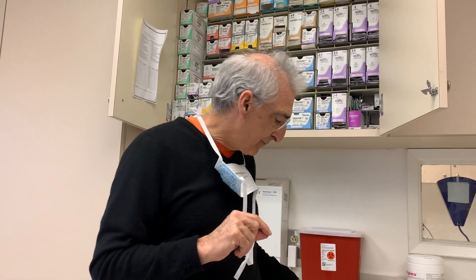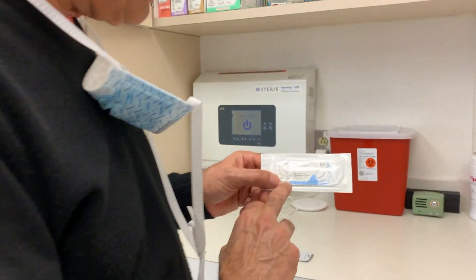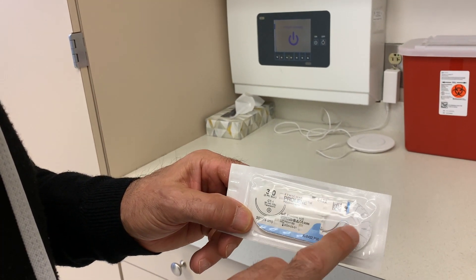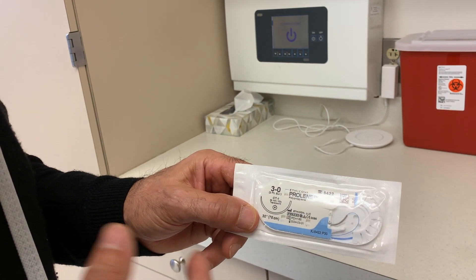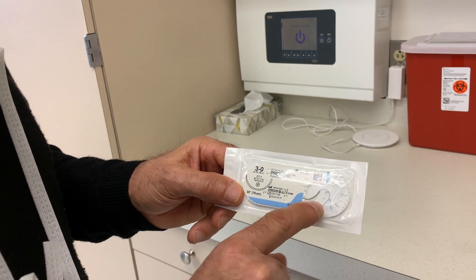The other factor, besides the suture material itself, is the needle. Needles fall into two categories: needles that are sharp at the tip and cut, and needles that are tapered. On our suture packaging, it will show us all that information — what the suture looks like — and we can tell from the brand whether it's monofilament or braided.